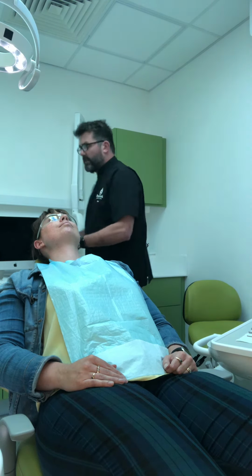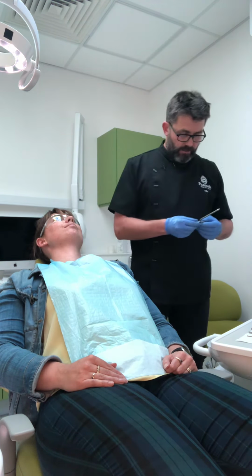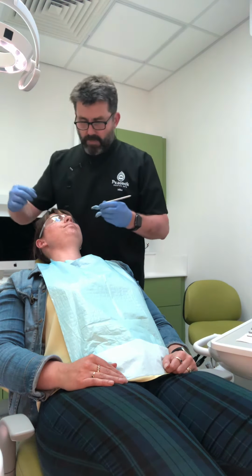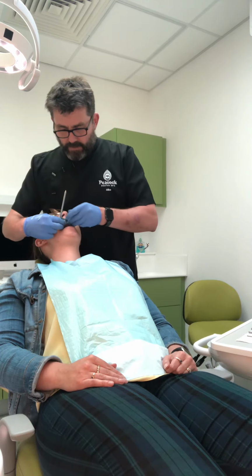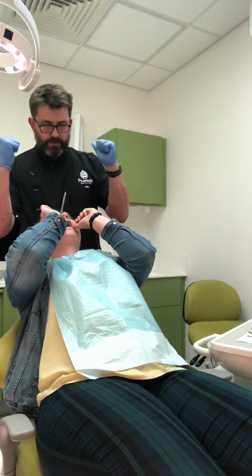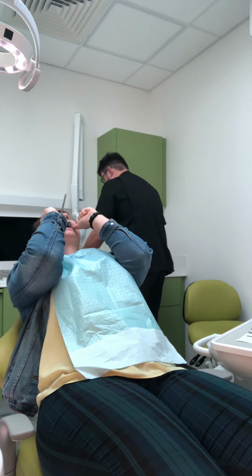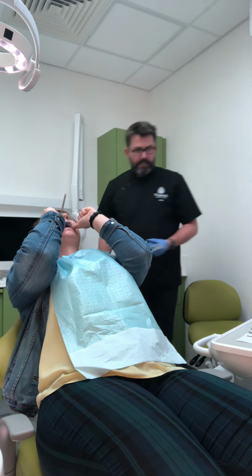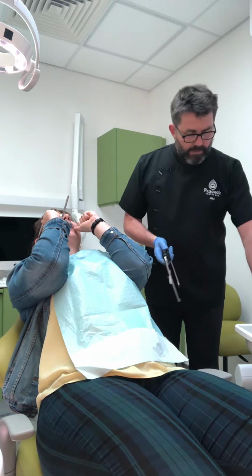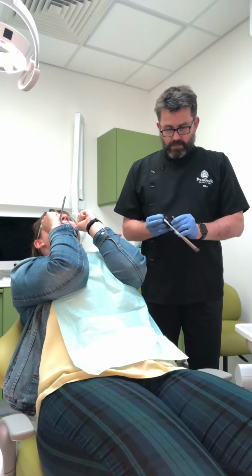So now I need to brief the patient because holding this in place for a while can get quite tiring on the arms. So I'm just going to reposition it and then just give them some instructions. So I'm just going to pop this back in. And if I can get you to bring your thumbs up just about where my fingers are, please. Lovely. And then clench your fists to keep the mouth on. That's perfect. Thank you very much. And that's pretty much all the briefing you need. Next we go to the Facebow and apply the jig. Tuck your arms into your shoulders there, into your chest, because otherwise I get tired.